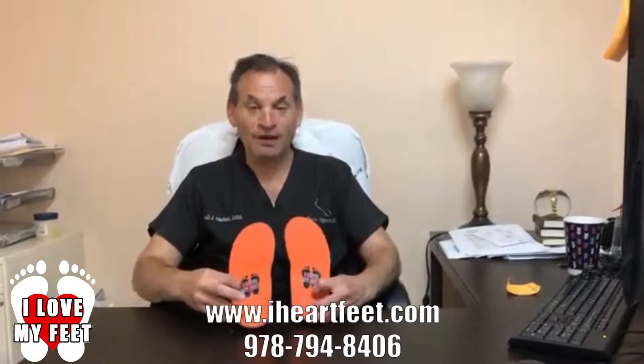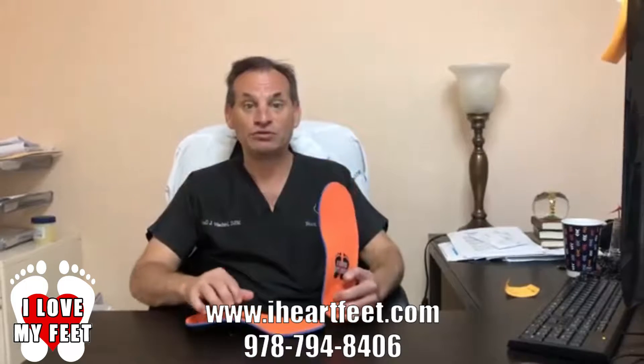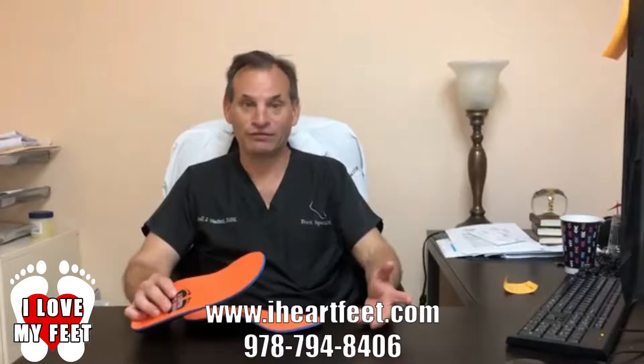Hi, I represent a company I've just developed called I Love My Feet. Basically these are inserts — devices that go into your shoes. These are different than most of the inserts you're going to see on the internet.